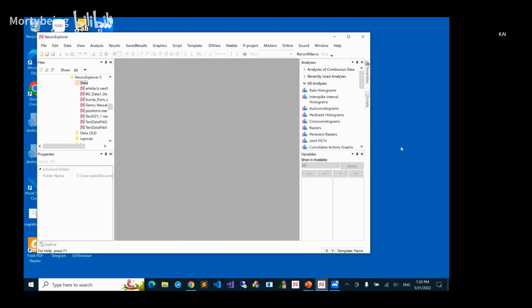I mean, do some of your customers use NeuroExplorer to do analysis online with NeuroOmega, during the surgery? Do you have some experience before? For online analysis.